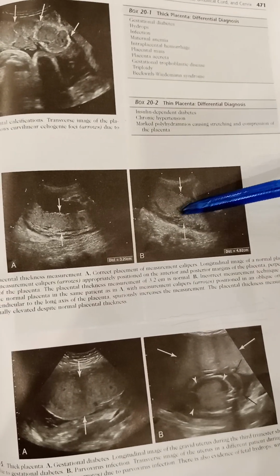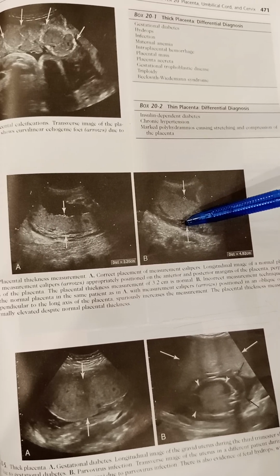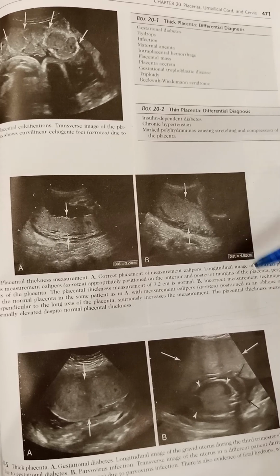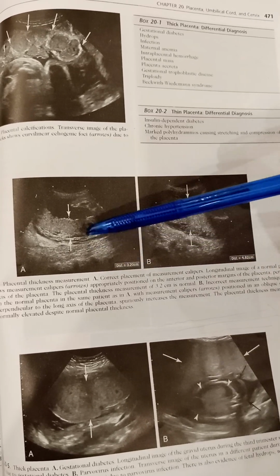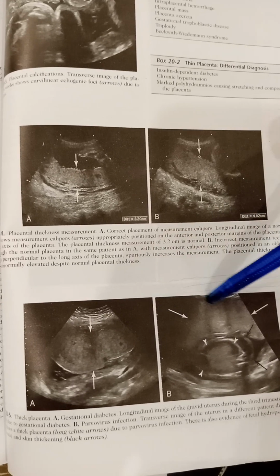Over here, the placenta is obliquely placed, and the calipers are not perpendicular to the placenta. So the measurement over here is greater. It is 4.8 here and 3.2. So 3.2 is correct.